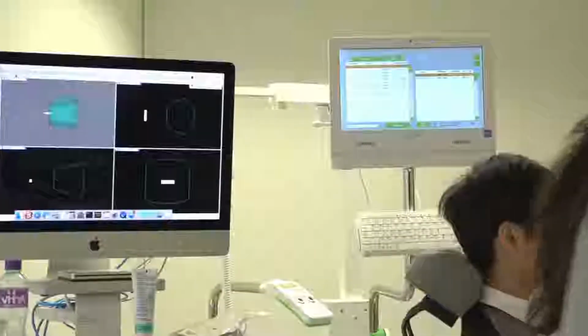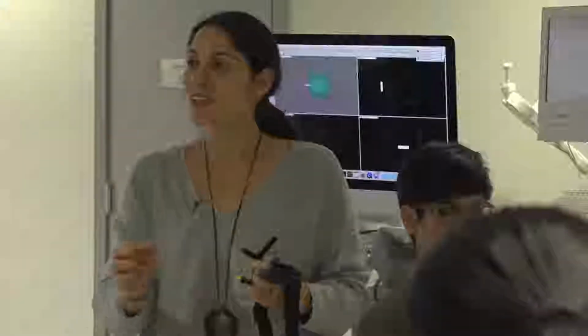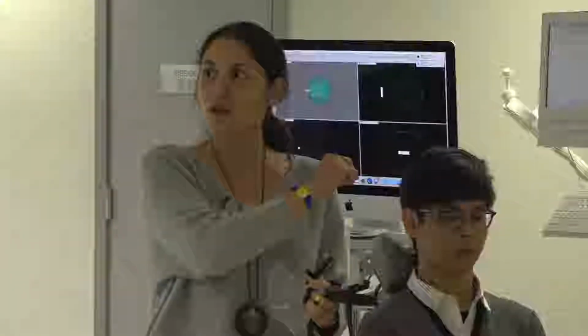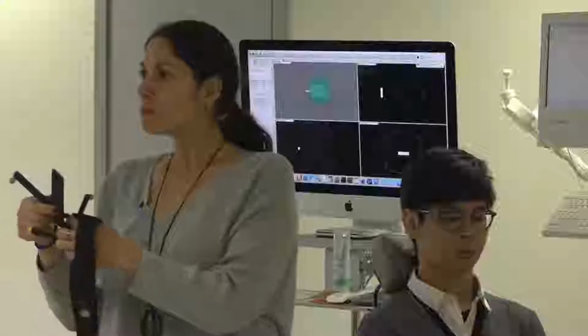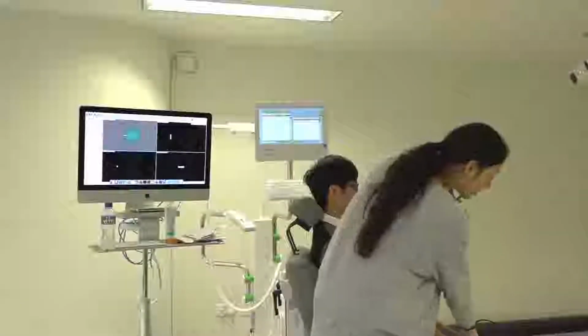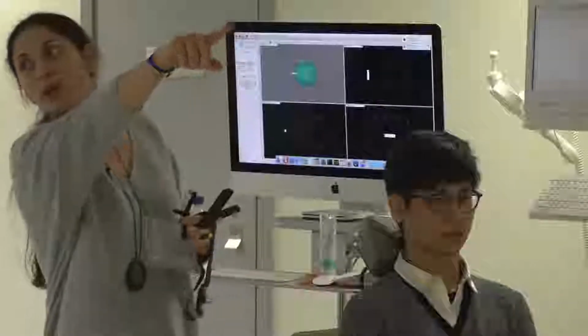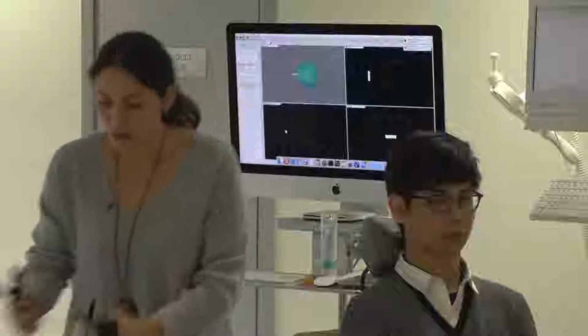There are some marks here. Yesterday we tested and tried to find the position where my camera will be located, because I assure you that it can take a really long time until you get the right position so the camera can see the subject, the coil and the tracker. So when you have a TMS lab and you are always going to use this, try to position the camera in a way that you keep it there and it will be able to see what you want. You can also see the marks here. We tested everything, where we put the chair, where we put the camera, and it should work. Hopefully it will work, at least for this position of the camera. We were testing this position yesterday.